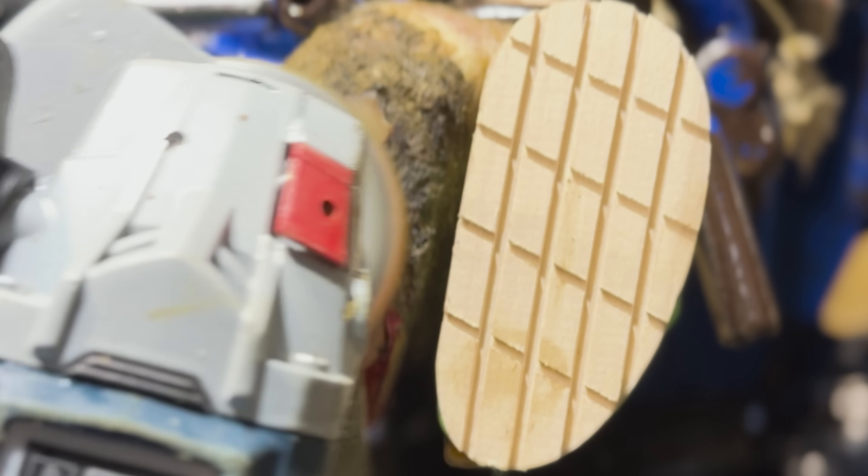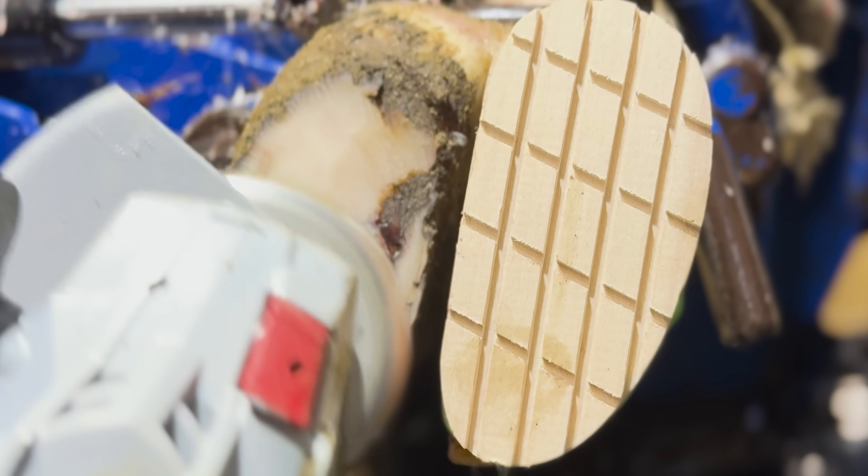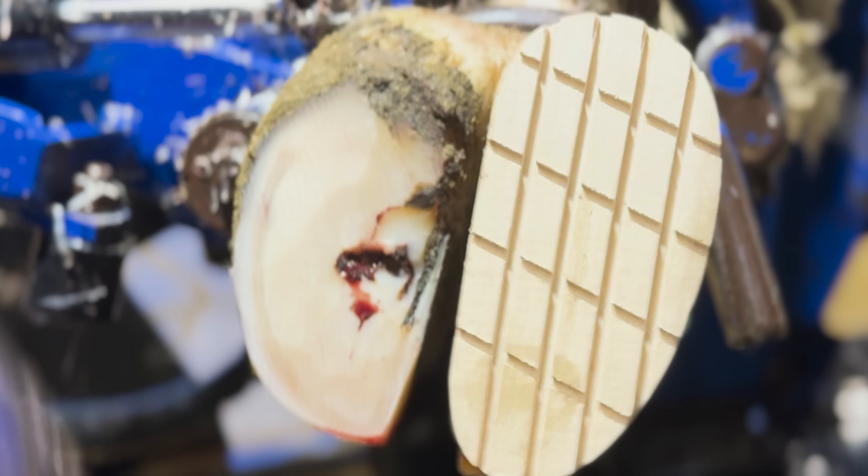We're going to use a grinder just to gradually thin the thickness of the horn, because this hoof horn is incredibly hard. By thinning it with the grinder, it makes this trimming process just a little bit easier, and will hopefully limit the amount of discomfort this cow is in while we're doing this. Now there is going to be a little bit of claret coming out — that is all just infection running out of this hoof. The claret does stop, and all of this infection that's bubbling out is all just built-up pressure within this hoof. That is why she's struggling so much to bear any pressure on this hoof.